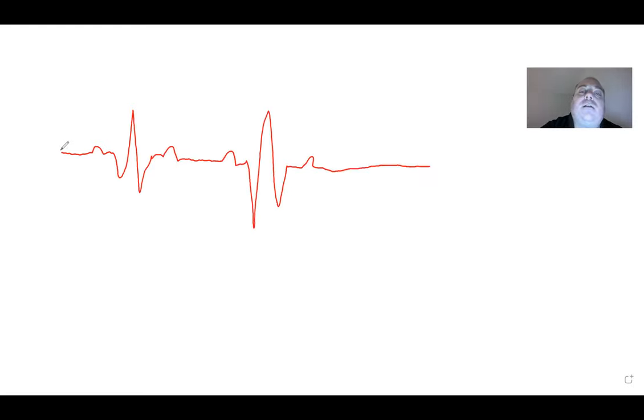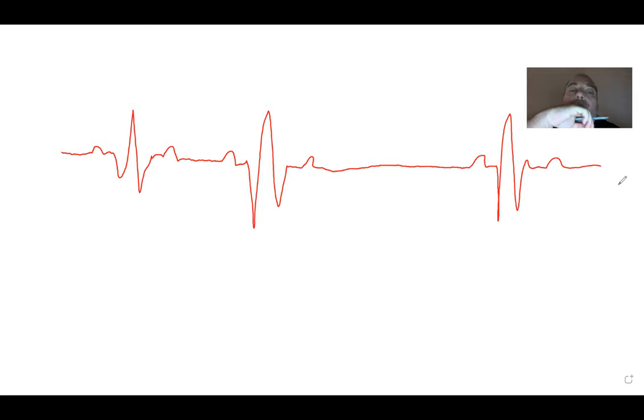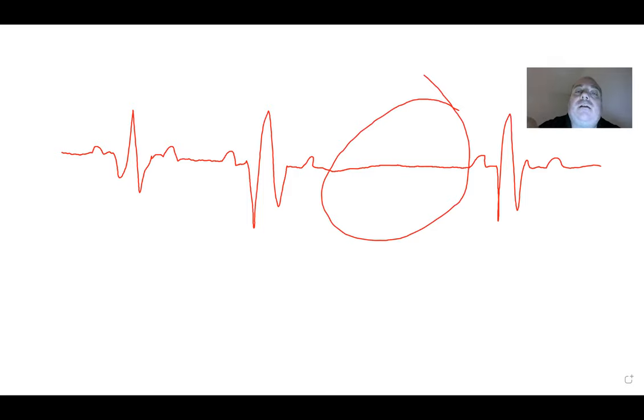So when it comes to sinus pauses, like I said, you have a sinus block and then a sinus arrest. Okay. So if you were to have a P, a QRS, and a T, a P, a QRS, and a T, a whole lot of nothing, a P, a QRS, and a T, okay? Basically, what we're looking at is, when we had a period like that, when it picked back up again, did it pick back up on time, or did it not pick back up on time, okay? So that's what that means.